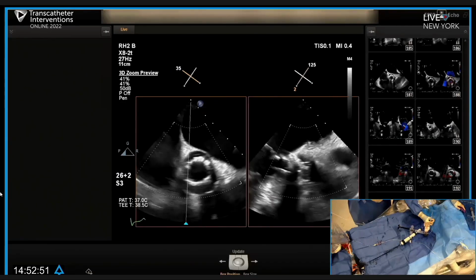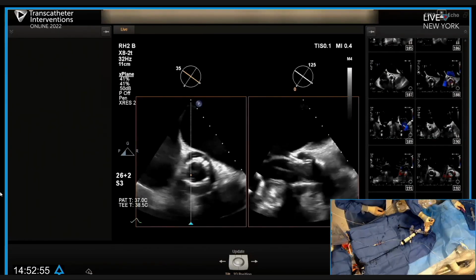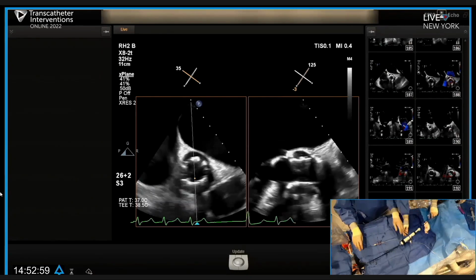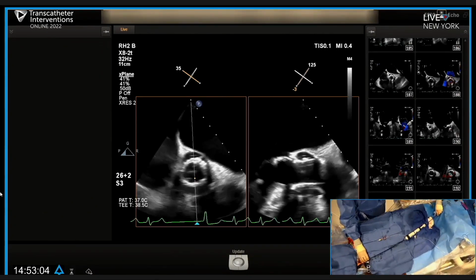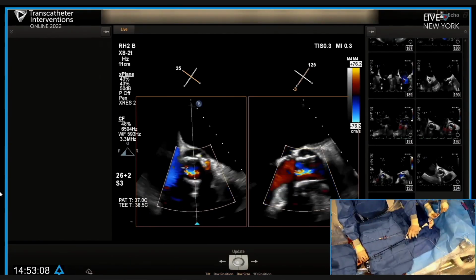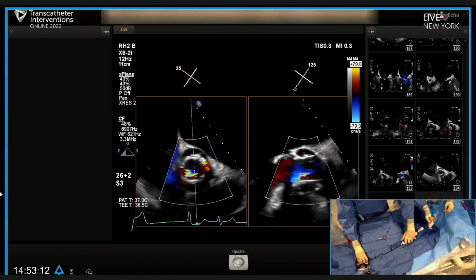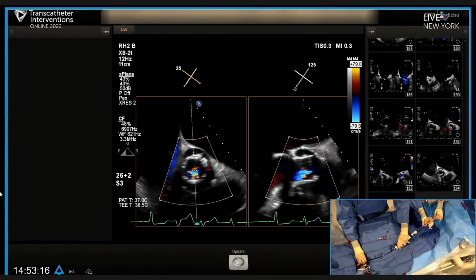I felt safe doing so in terms of contralateral injury. Becky didn't see anything. Nothing. So yeah, you could see how the valve is really pushed posterior in the aortic root because that commissure was so asymmetric. But the expansion, the position otherwise is really lovely, I think. You can really see it well from that orthogonal view. And then that central leak is typically from the wire. It's just the wire, isn't it?